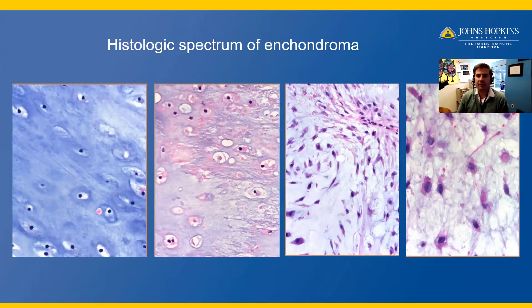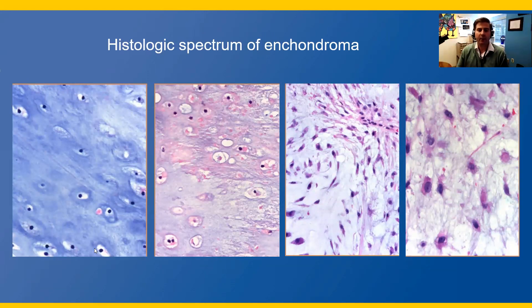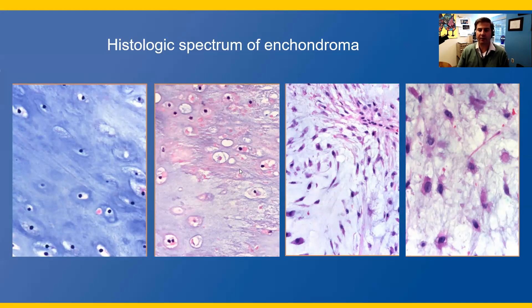The histologic spectrum of enchondromas is interesting. On the left, cells are quite small and lymphocyte-like. In the left center, you may find an occasional binucleated cell. In the right center, some cells may be spindled and relatively hypercellular. On the far right, you may have some cytologic atypia. Cytology itself is not specific for enchondroma versus chondrosarcoma — you need correlation with radiographs and the low-power permeative growth pattern that is seen in chondrosarcomas but not in enchondromas.